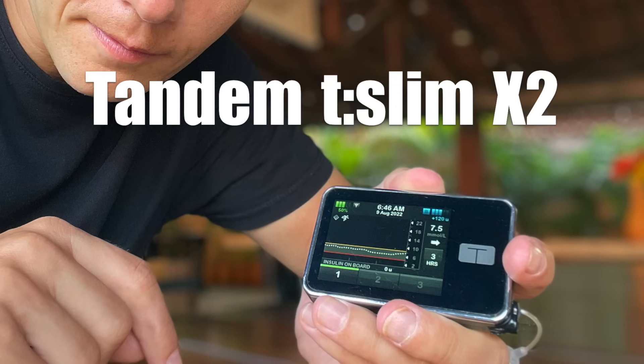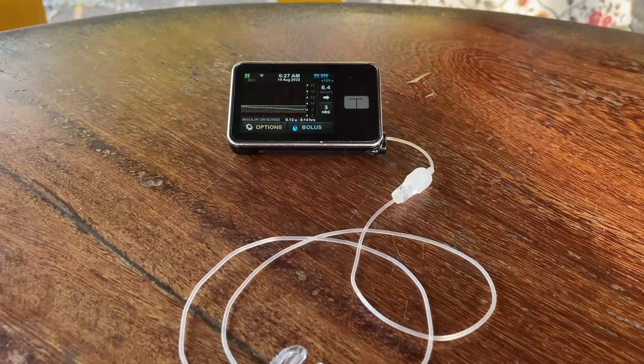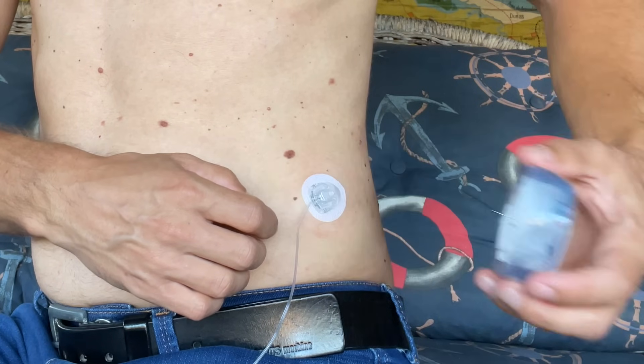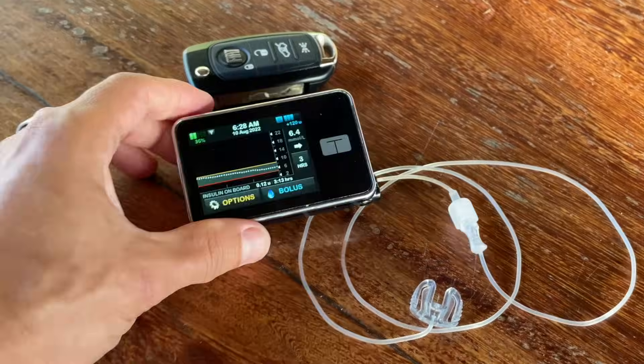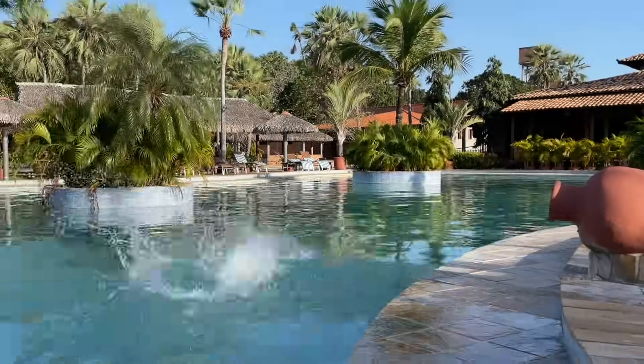The Tandem T-Slim X2 insulin pump continuously delivers insulin to your body through a tube and cannula that you apply under your skin. No more insulin shots. Plus it's a super smart pump packed with technology that will take a lot of work off your plate.